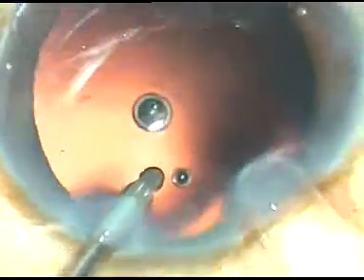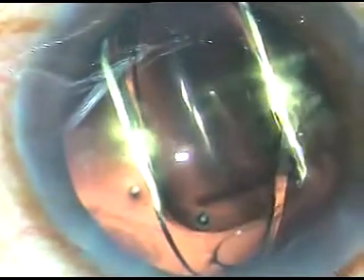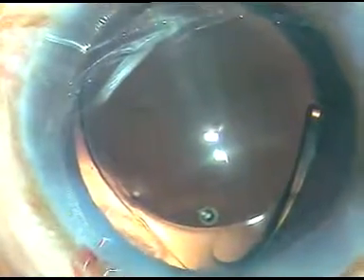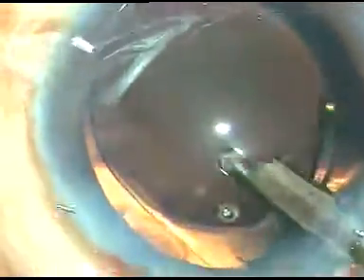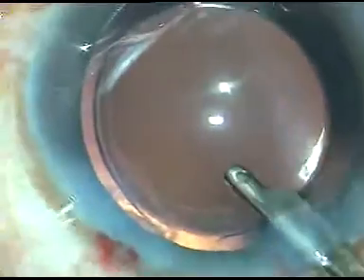The posterior capsule has been polished. Now this is the lens. In this case, I am using a hydrophobic acrylic intraocular lens, and it is being implanted under irrigation. The leading haptic has gone into the capsular bag. Now the trailing haptic has also been placed in the bag. The lens is unfolding very slowly. This is actually Acriol from IO-Care. This lens is quite good — I have not seen much glistening in this lens over the past several years.